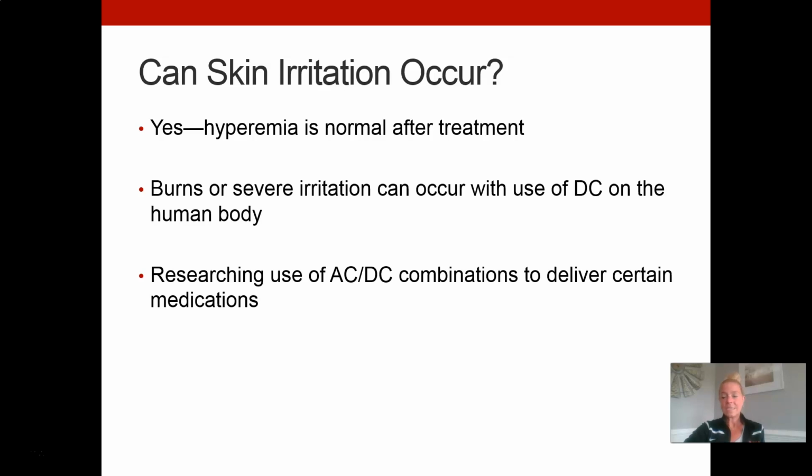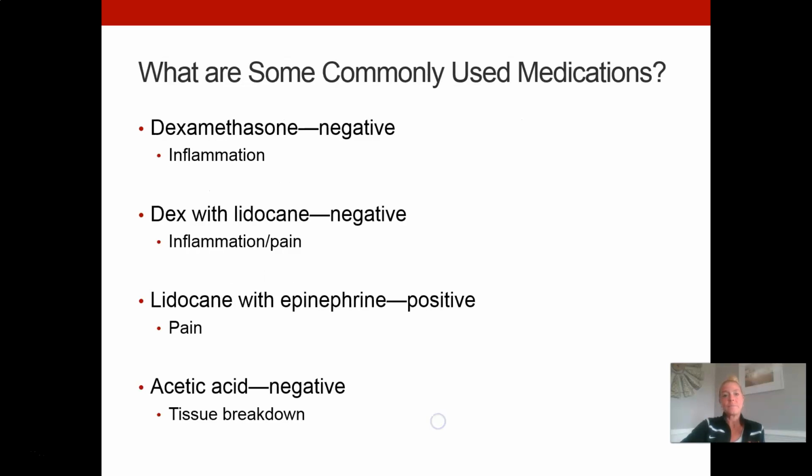But like I said, it's a different sensation than the other types of e-stim. I have personally had it. I think it's done wonderful things for me. It's been very helpful, and I can tolerate it up to 4.0 on every machine that I have tried. So everyone's going to tolerate it a little bit differently.